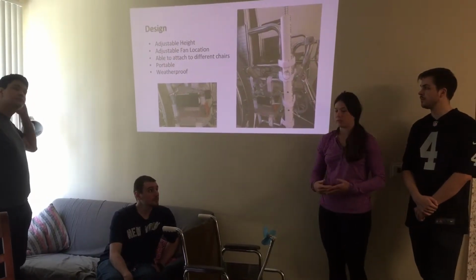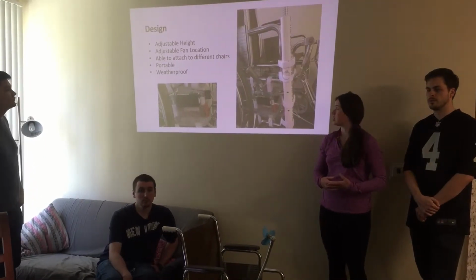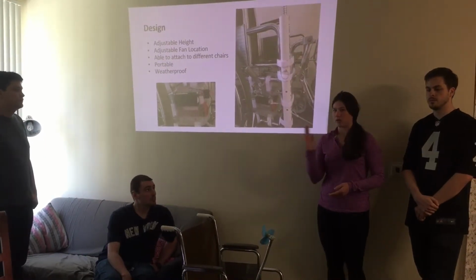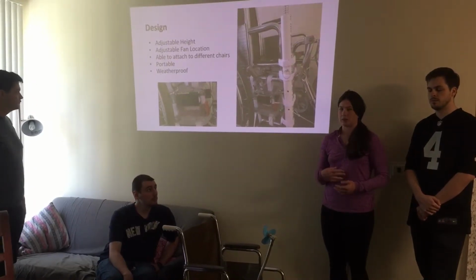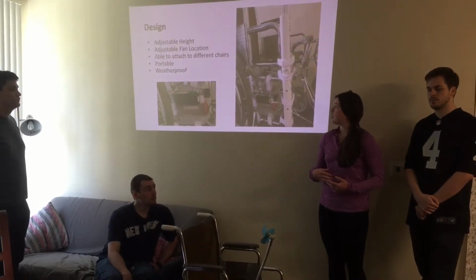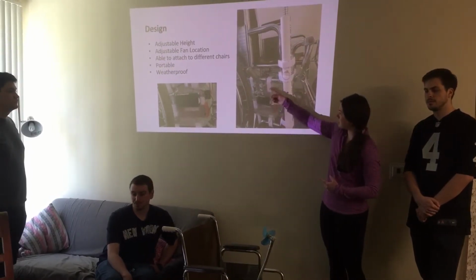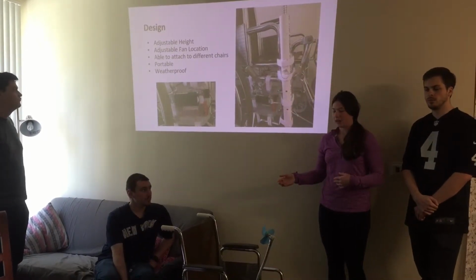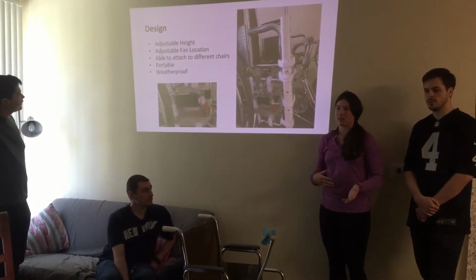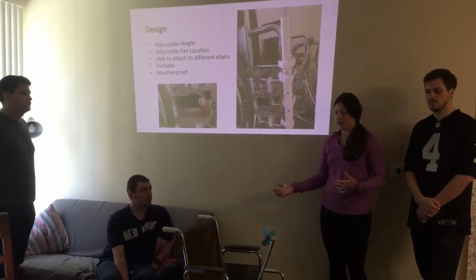We also wanted to be able to adjust the fan location, so we used a gooseneck connection so that you can move it backwards or forwards to angle it towards wherever you need it to be, and adjust it so it can come a little bit more in front of the user. To make sure that it was adjustable for different chairs, we used many Velcro straps, as you can see in these pictures, so that you can adjust it from chair to chair. And since the chairs are slightly different makes, it'll be able to be used whichever one you have.